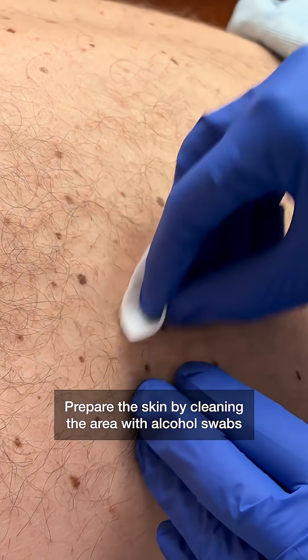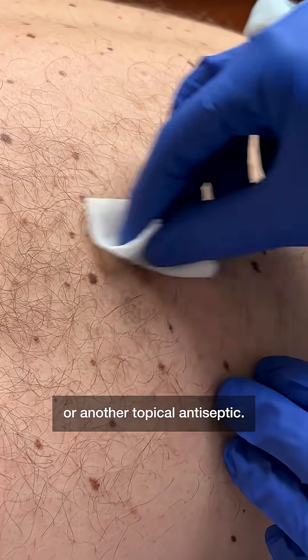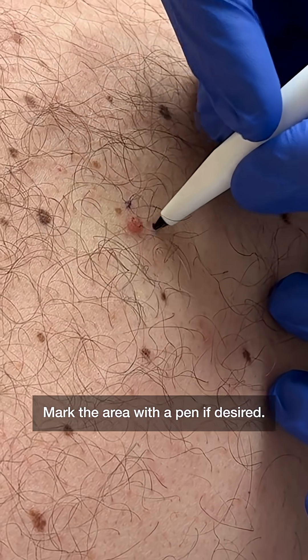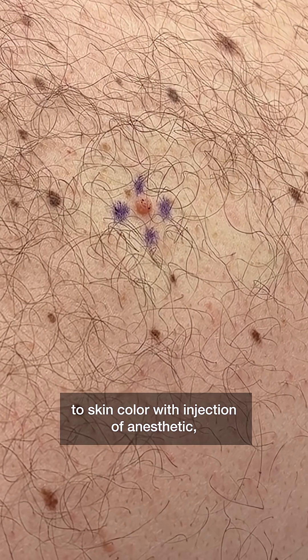Prepare the skin by cleaning the area with alcohol swabs or another topical antiseptic. Mark the area with a pen if desired. This can be helpful if a flat or thin lesion blanches from pink or red to skin color with injection of anesthetic, which can make it hard to locate.